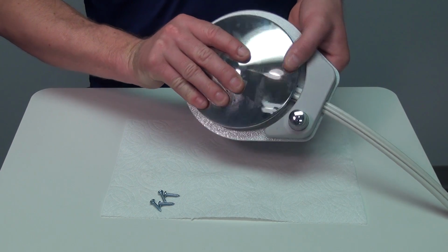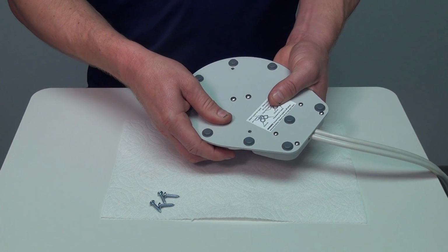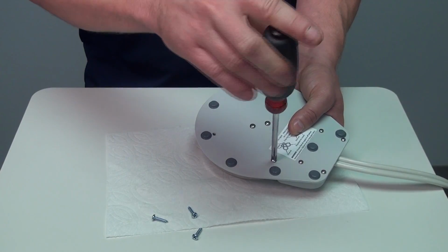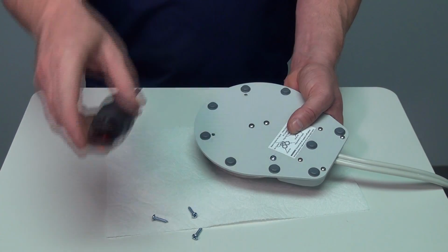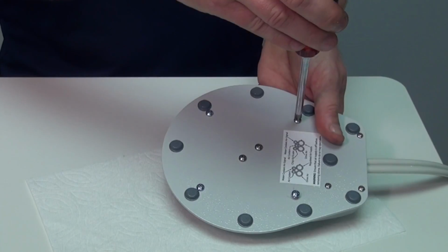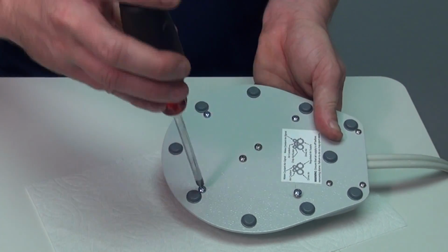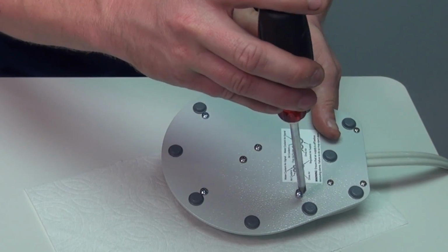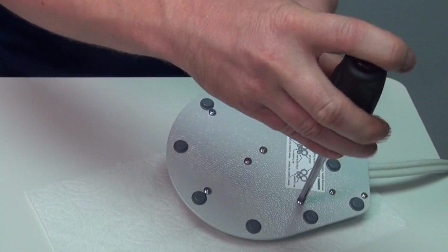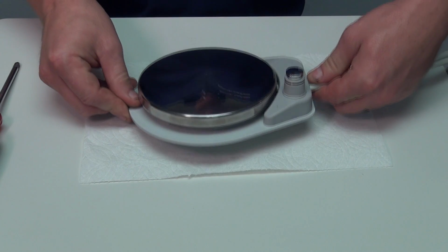Hold the foot control plate together, flip upside down, line up the holes, tighten the first screw down without going completely tight first, so there's a little play in the pedal so we can line up the remaining holes. Check the screws, make sure all are tightened now. Once the 4 screws have been tightened back down, flip the pedal upright.